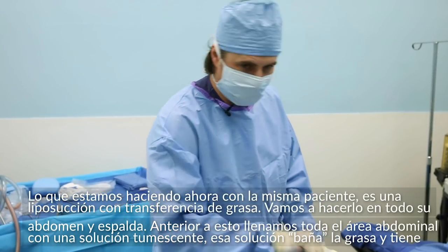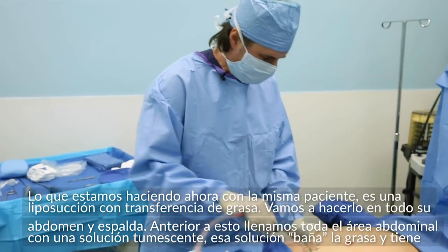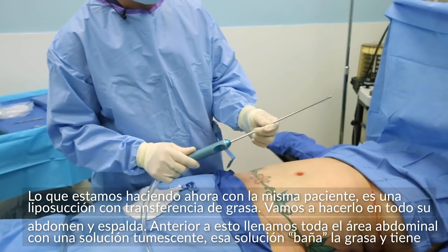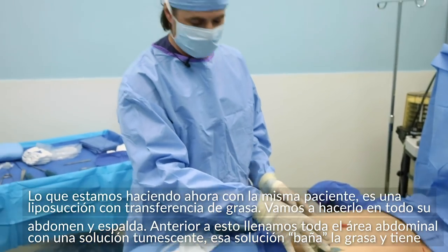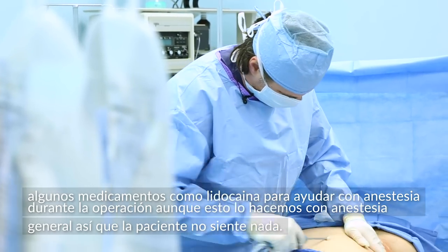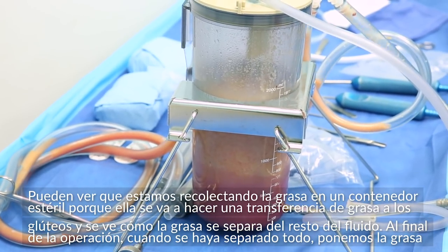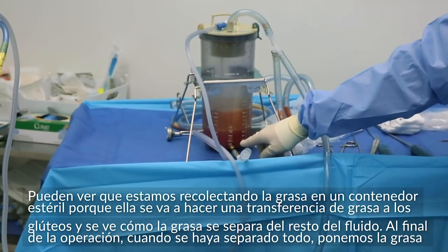Now we're doing the liposuction with fat transfer on the same patient — we're going to liposuction her entire abdomen and her entire back. I'm in the liposuction portion right now. This is the liposuction cannula. Prior to this, we filled the whole abdominal area with a tumescent solution that bathes the fat — it contains lidocaine to help with numbing during the operation, though this is done under general anesthetic so she feels nothing. Since she's doing a transfer, we're harvesting this fat in a sterile container over here, and you can see the fat separating from the fluid.